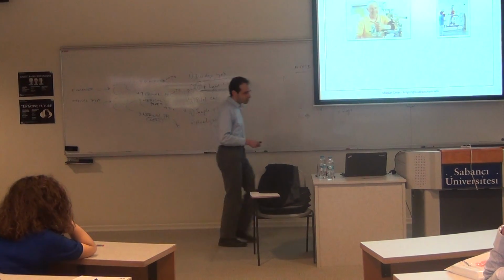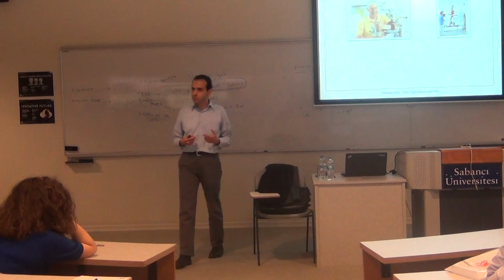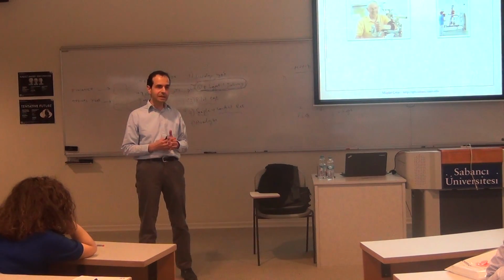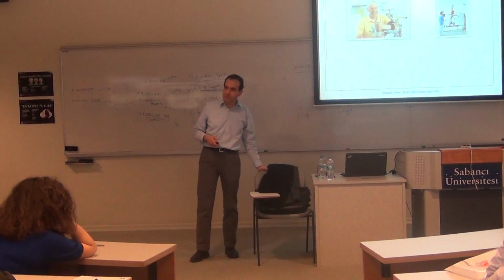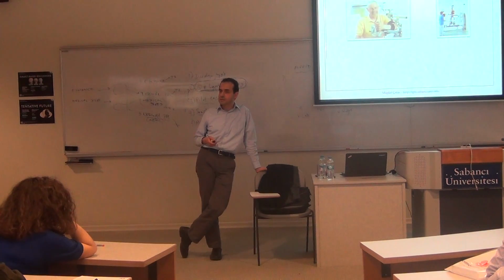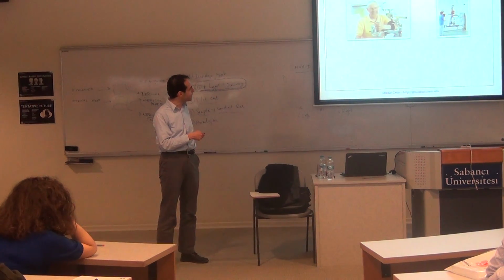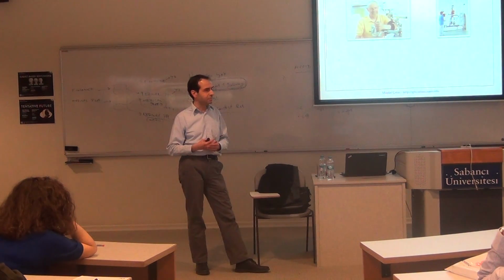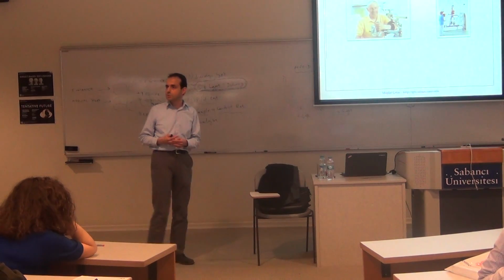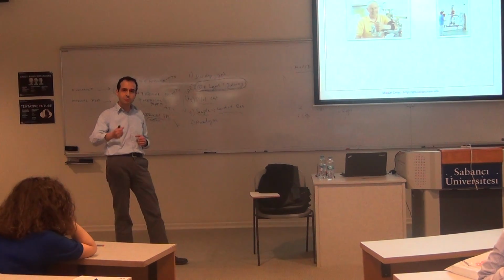The last thing I'll sort of talk about quickly is that up to this point, I talked about communication, use of BCIs for communication. Now, in this piece of work, for the last 3 years or so, we have been thinking of and trying to use brain-computer interfaces in rehabilitation, robotic rehabilitation of stroke patients. So the background here is that when a person suffers stroke, immediately after stroke, the person should start physical therapy. Conventionally, this is done by help by a physical therapist. Over the last 20 years or so, people have developed these rehabilitation robots. So the robot helps the patient do certain types of movement.